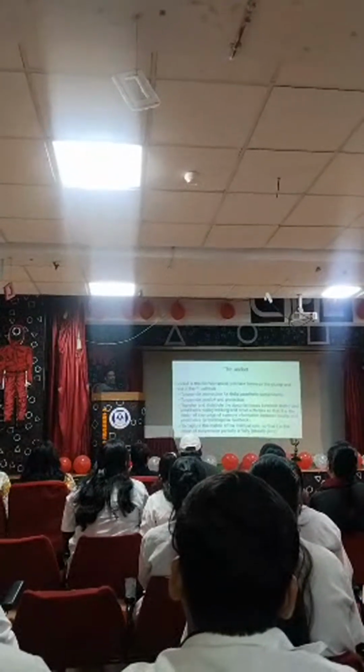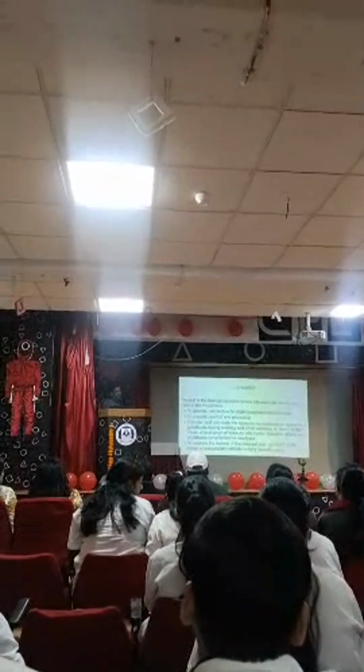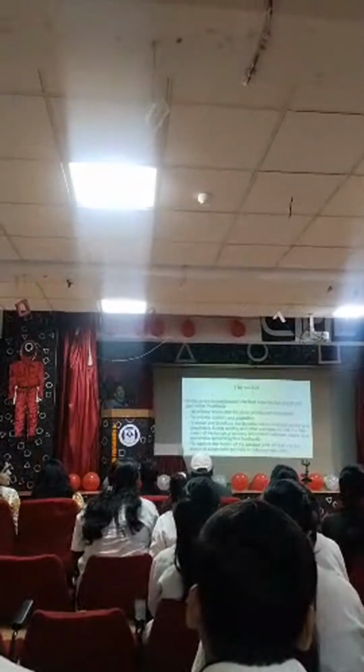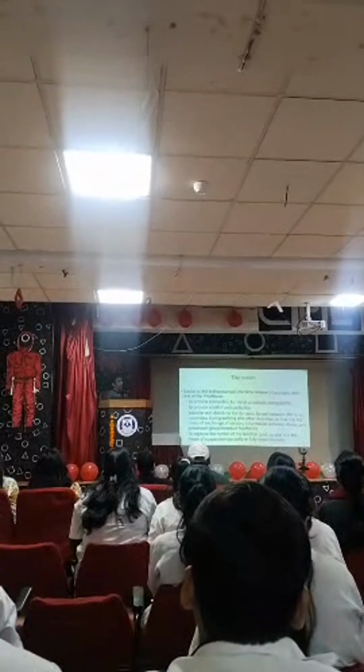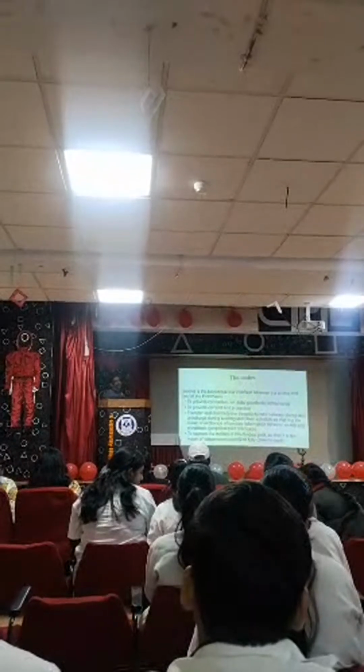So what are the main functions that the socket gives? After giving connection, it is also providing comfort and protection, most important protection. Because as a prosthetist and orthotist, mostly we know that the socket is for providing function. But functions are many, right? Many types of functions are there.